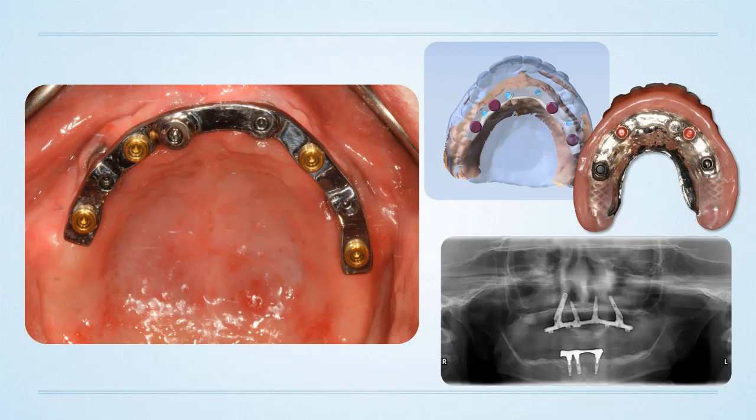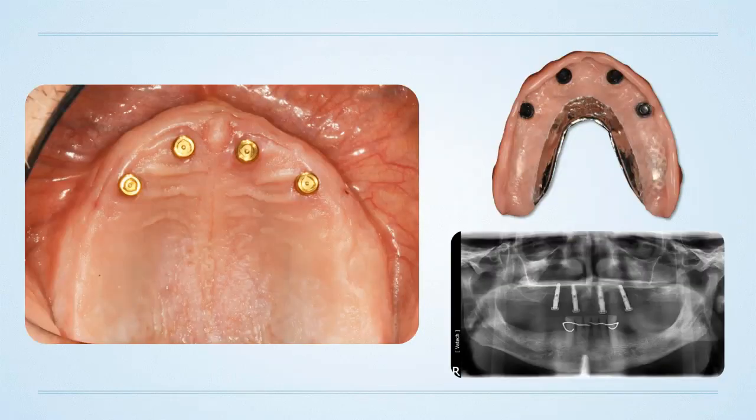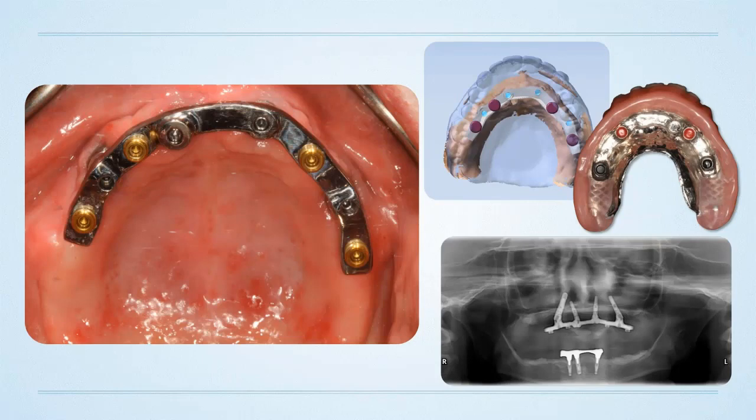Why? It's because bone density is a little bit lower on the maxillary arch compared to the mandible. So typically on my mandibular arch, I'm doing individual locator abutments for these patients. On the maxillary arch, it's kind of an 80-20 split, meaning 80% of the time it's going to be more like this, 20% of the time will be like this. For those patients with low bone density, maybe it's an osteoporotic patient, maybe a patient with a big old bulky denture, one of these patients that wants their denture to puff out their lips to make them look 20 years younger. Yeah, we all treat those patients.